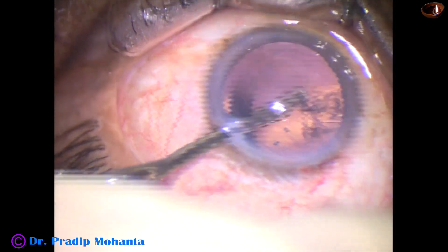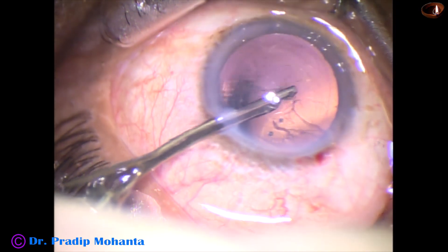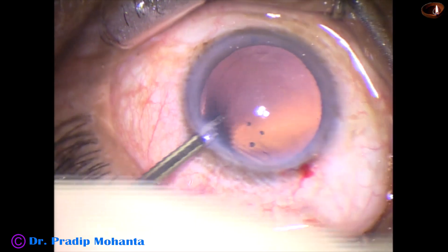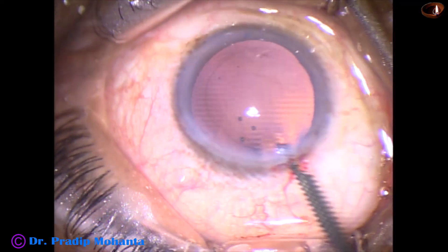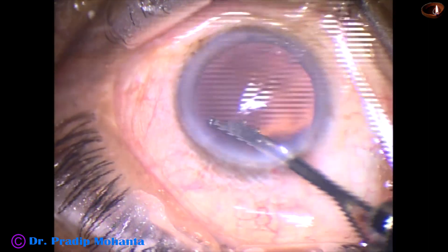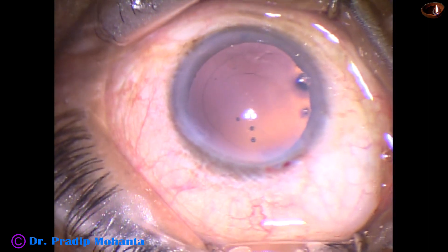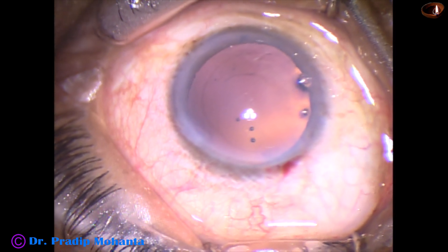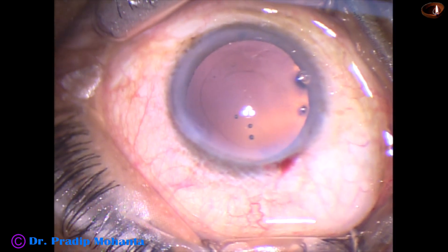And now the rest of the cortex — sub-incisional cortex — can be removed going through the side port. This is a 23G Simcoe. Only one side port has been made, and the width of the side port is about 1.6 or 1.7 mm.